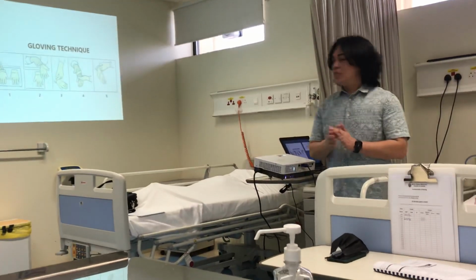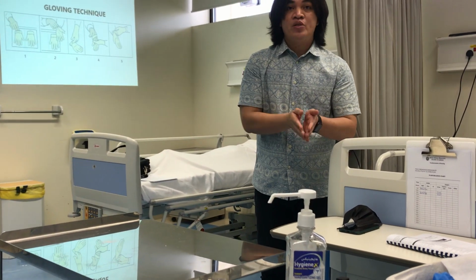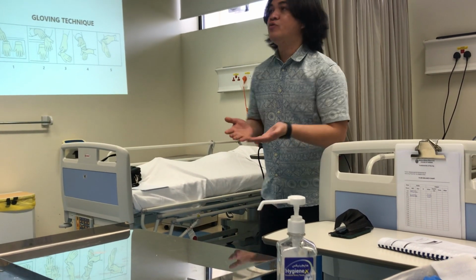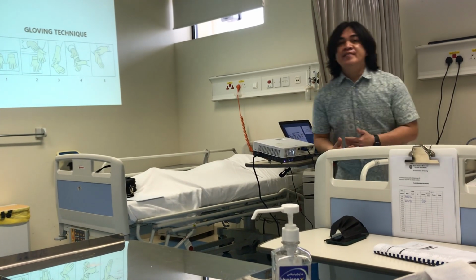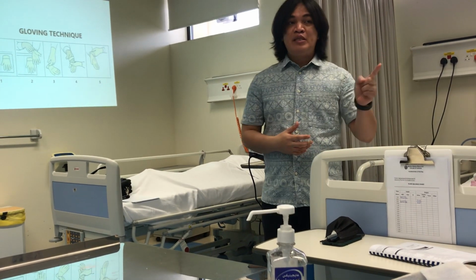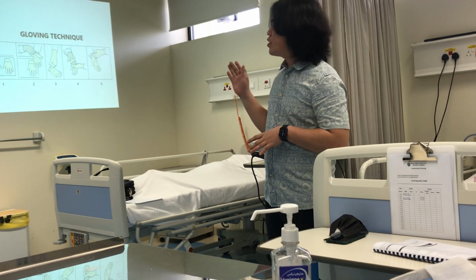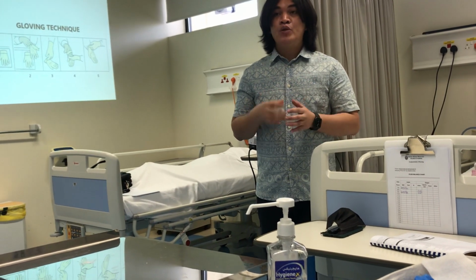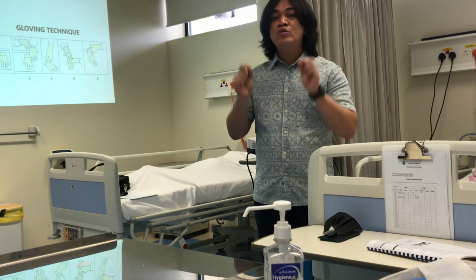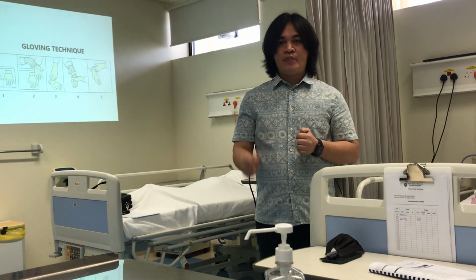Gloving technique, okay? You can show it to them, but you will demonstrate it later on so that they will see exactly how you do your gloving. And this procedure requires technique, unlike the clean gloves technique. No technique is required. But this one, we follow certain steps because we do not want to contaminate the gloves. Because our goal here is to keep all the things that we use with the patient as sterile as possible.